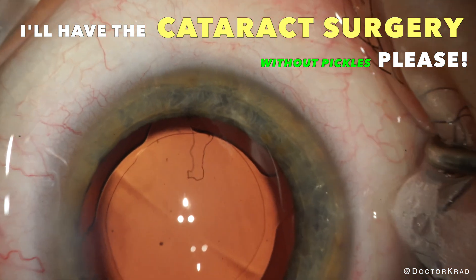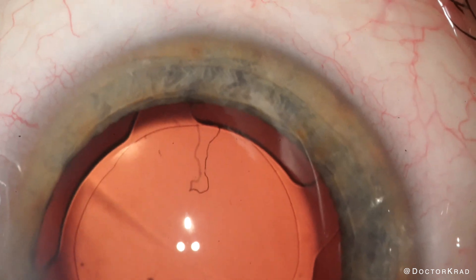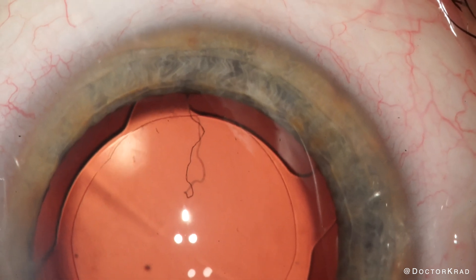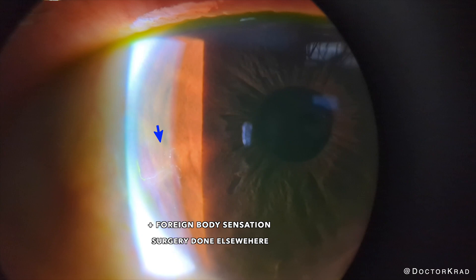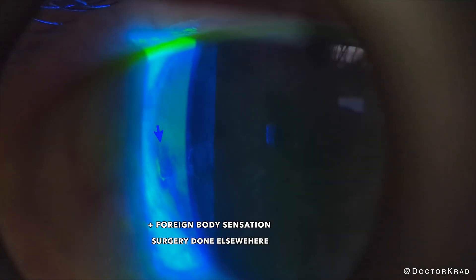Hi everyone, it's Dr. Cradd. It's not uncommon to see blue fibers on surgical instruments during cataract surgery. Although they may be inert and harmless, these sterile fibers are really annoying and can inadvertently be left in the eye. What if they are contaminated? Where do they come from and how can you avoid them?